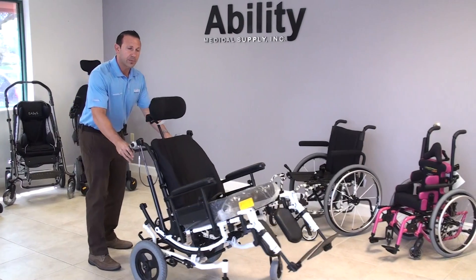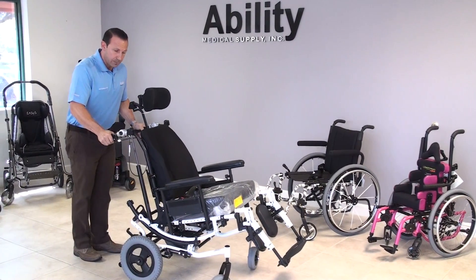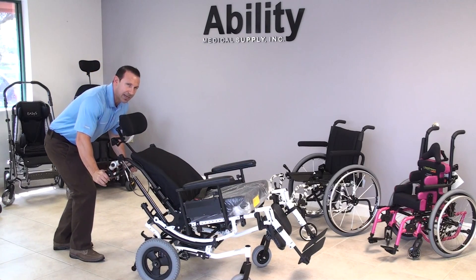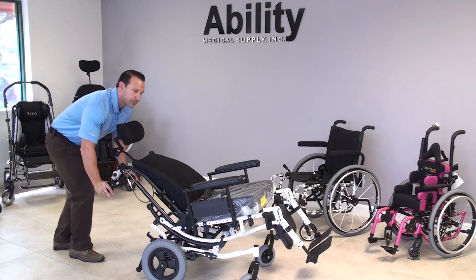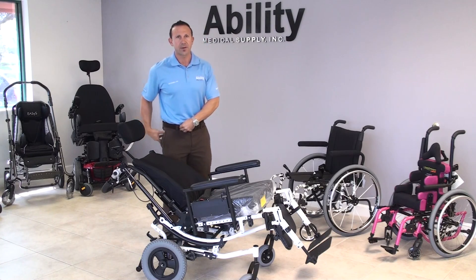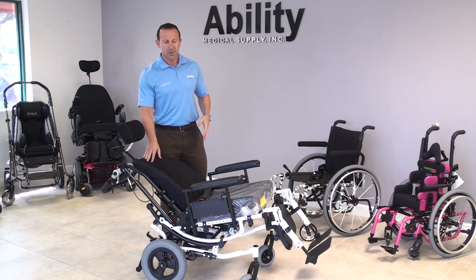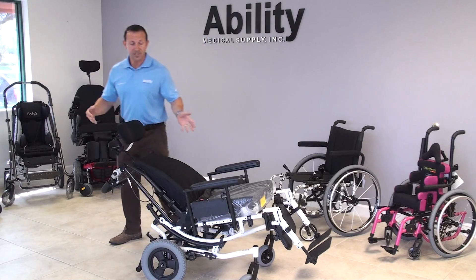This chair also comes equipped with what we call an independent recline, which means the back angle only can lay back as well. Recline is good for pressure relief, but it's also good for proper positioning of the pelvis. If it needs to be tilted either anteriorly or posteriorly, we can do that with the recline feature. It's also good for what we call a bilateral transfer.